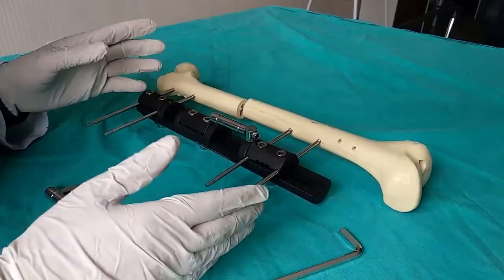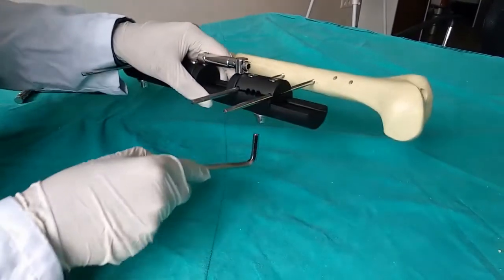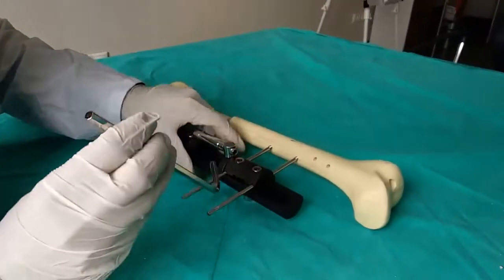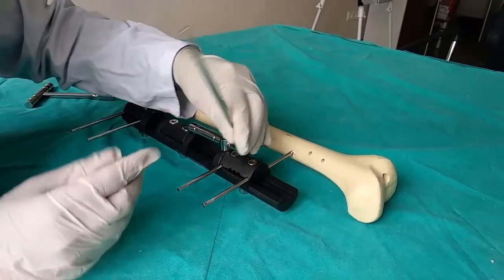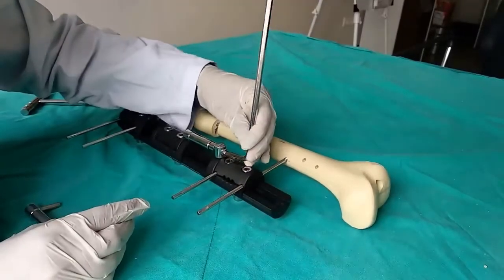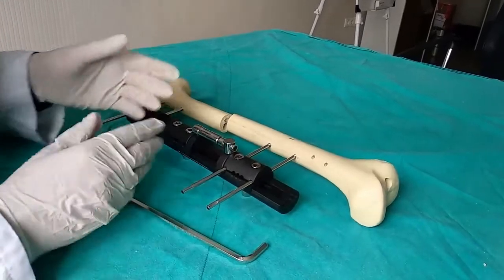The next step is that every day the patient or surgical team must increase the length by one millimeter. To do this, loosen the last clamp slightly. One turn of the compression and distraction part equals one millimeter, so rotate it 90 degrees four times. This can be done all at once or separately. Once done, the clamp is fixed again. This is the procedure to be performed every day.